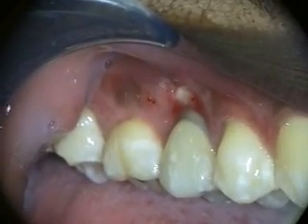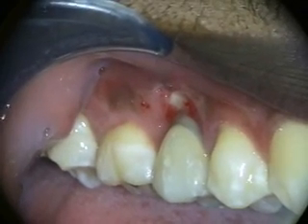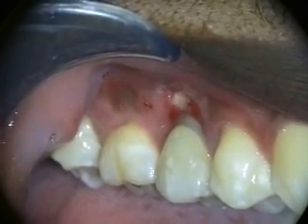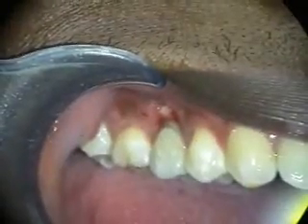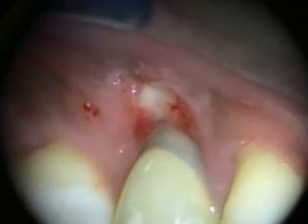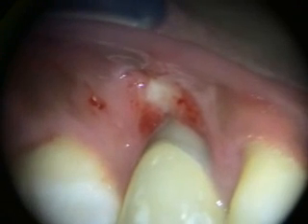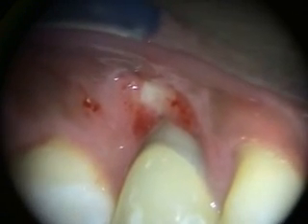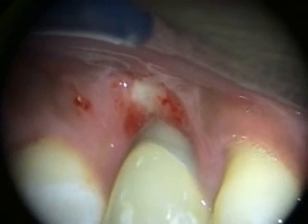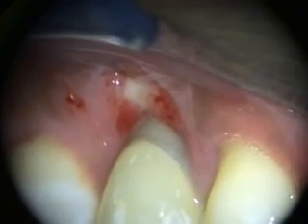This is three-week healing of the alloderm grafting. The last picture we took, the graft was exposed because I left some out, and now you can see that the soft tissue is growing into the graft. We're going to be packing this again and then we'll just keep an eye on things. But that's going to allow for a lot more root coverage than if we had not left some of the alloderm exposed.